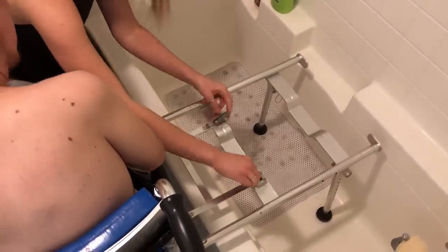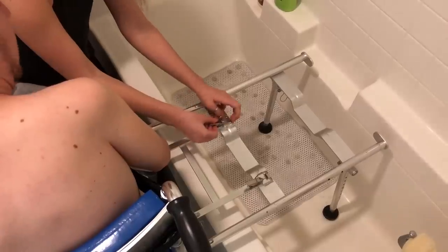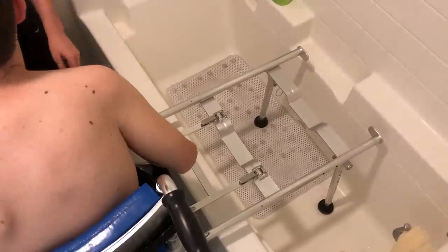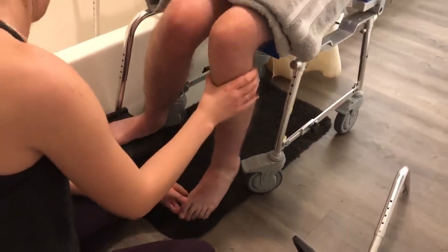Once we connect this final piece, there's a lever that's kind of underneath my legs that will basically slide me over into the tub. In order to slide over the tub, we have to take off the footrest.